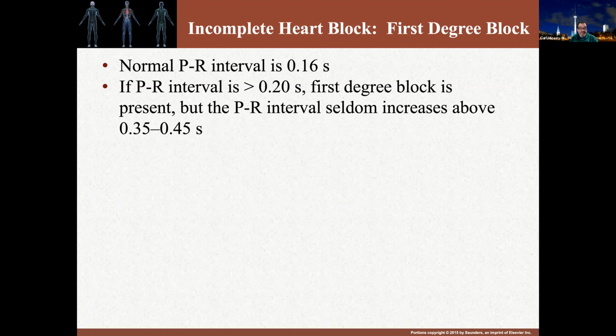The first degree AV block is characterized by a notable PR interval prolongation of more than 200 milliseconds. In this condition, the impulse traveling from the atria to the ventricles gets delayed because it travels slower than normal speed. Possible causes are enhanced vagal tone, again especially true in athletes and runners, diseases in the AV node, myocardial infarctions, myocarditis, medications or drugs, and electrolyte imbalances.